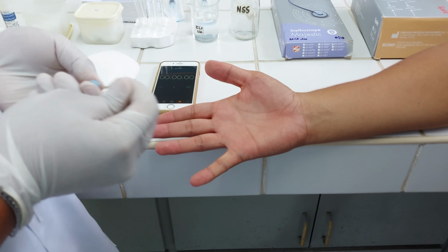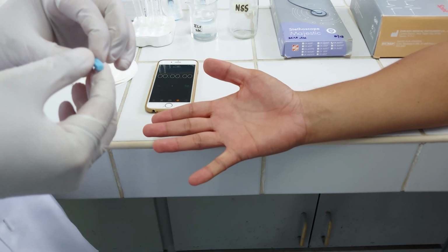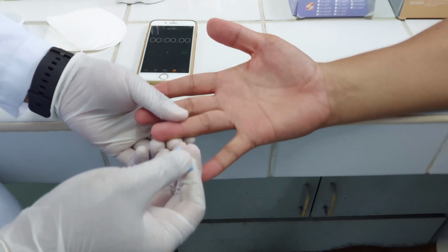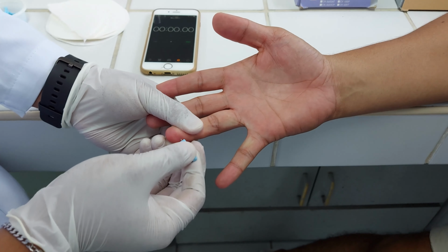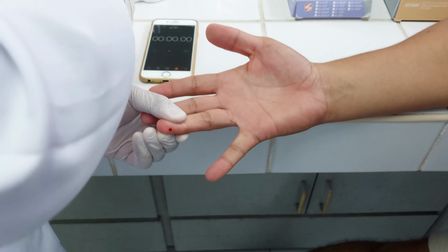Again, make sure to move the filter paper so that each drop of blood touches the clean area. And lastly, stop the stopwatch and record the time as soon as the filter paper shows no signs of blood.